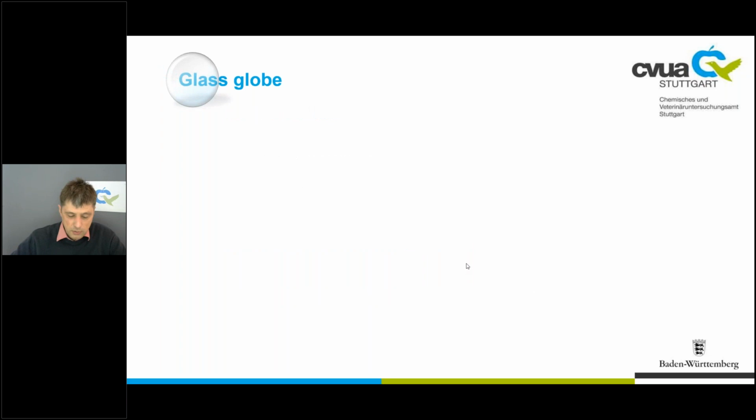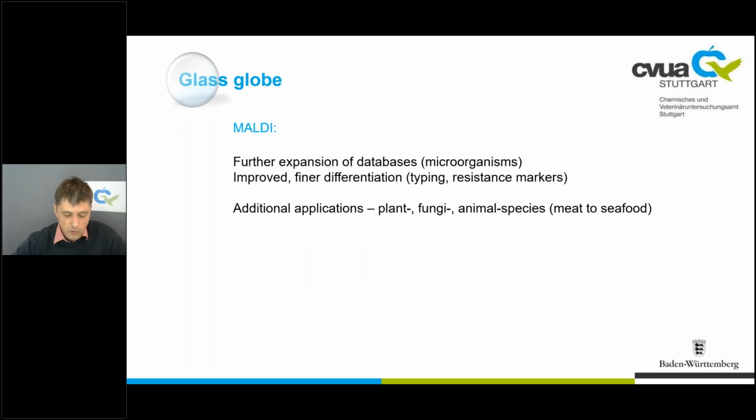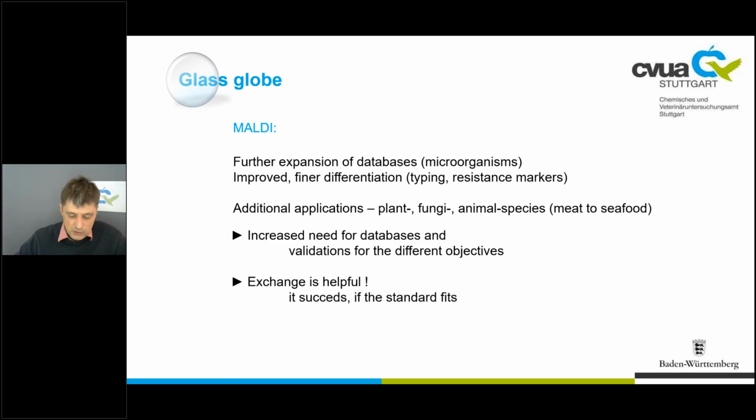And in future, further expansion of databases will occur. Additional applications will be more common also for other MALDI users, like plant, fungi, seafood, insects, or whatever. For these activities, new databases and validation processes are necessary.